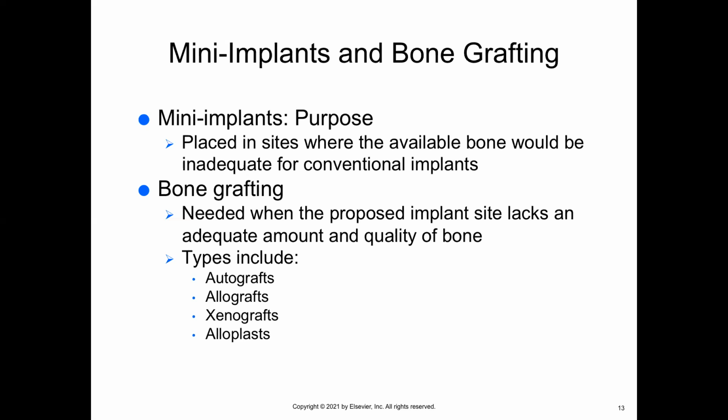Another kind of surgery that may be necessary when we're placing an implant on the maxilla. Sometimes when patients lose teeth, the maxillary sinus drops into the area where we would normally place the implant, and a sinus lift may be necessary.